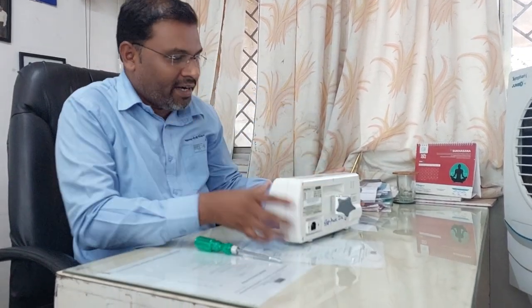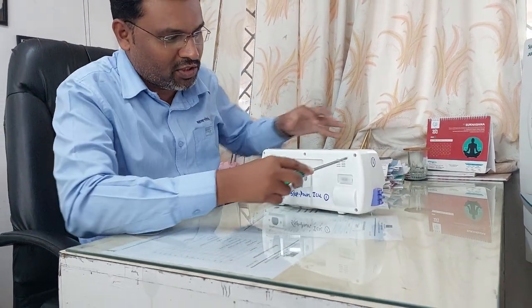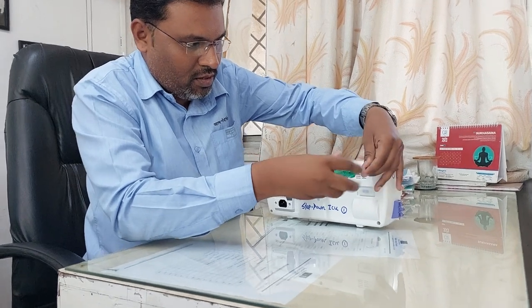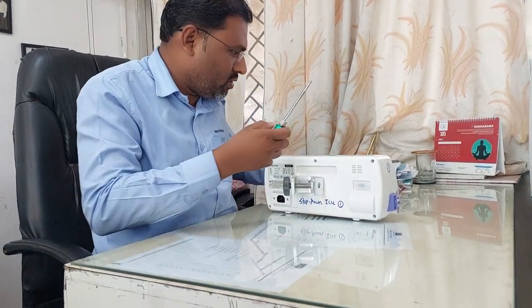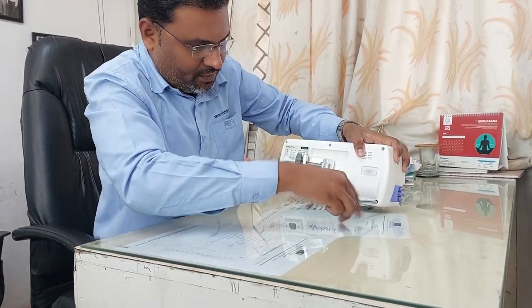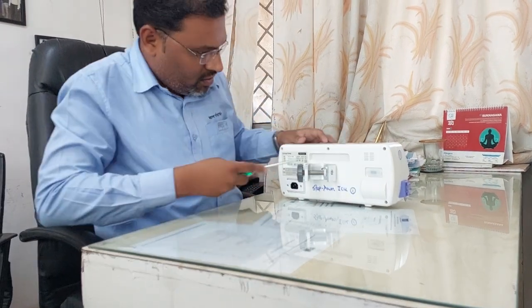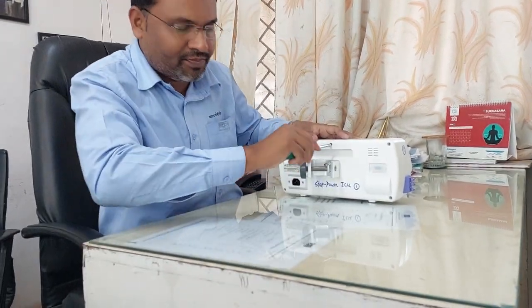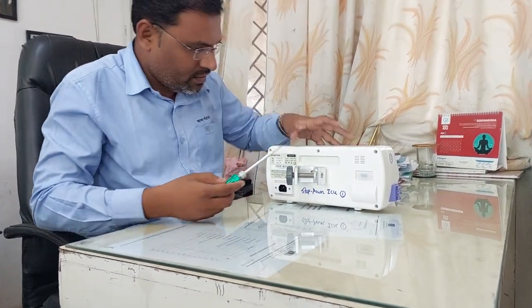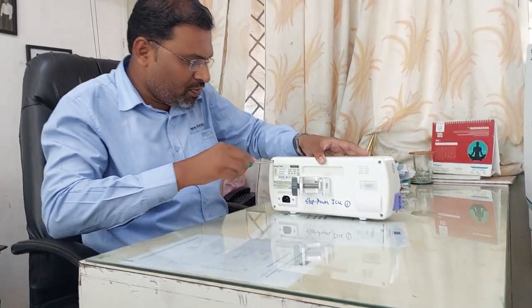They have provided 5 screws at the back side. First we have to open these screws using a screwdriver. In this way you can open the screws. For the remaining screws you have to use a plus screwdriver.